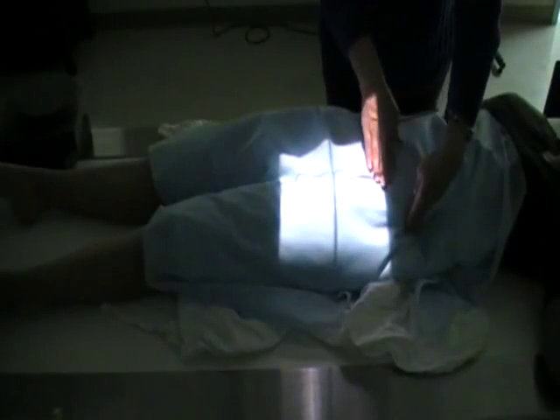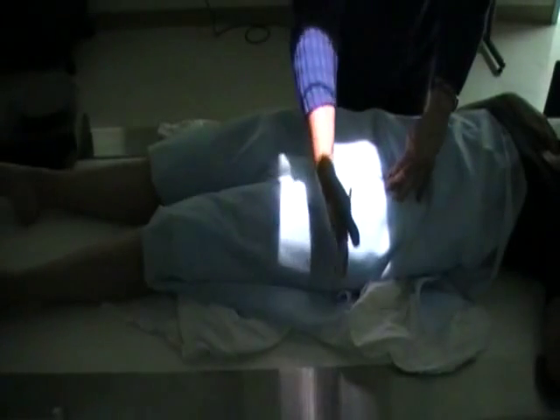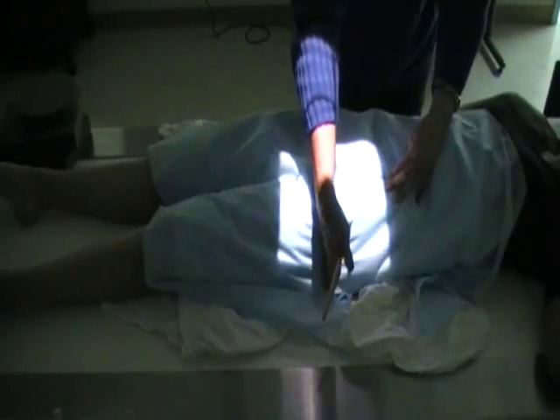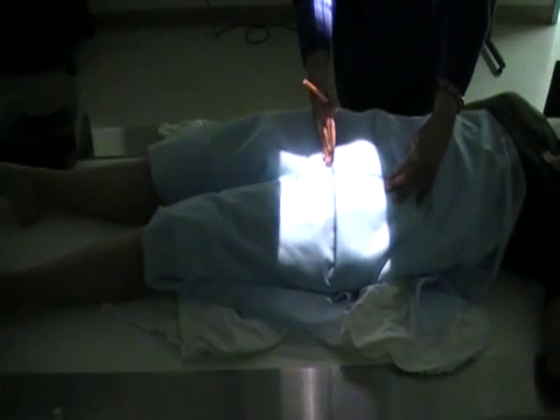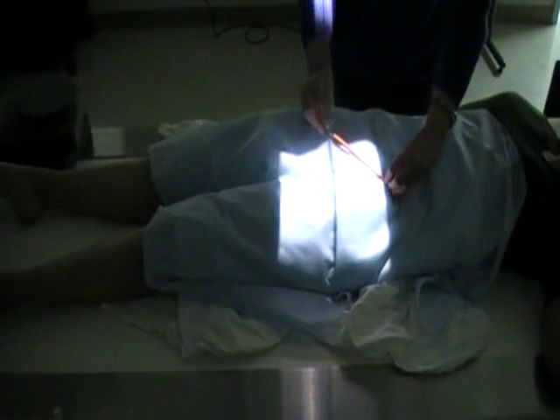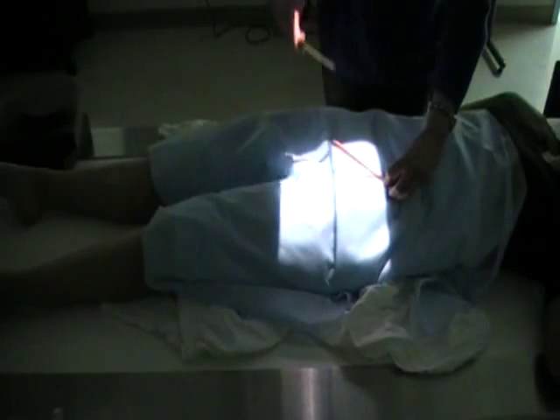For the hip x-ray, we're going to do the AP and the frog leg lateral. First on the AP hip, to help localize where the hip joint is, palpate on the patient the ASIS, and then the pubic symphysis is going to be at the same level as the greater trochanter prominence. So this is the level of the pubic symphysis. So we're going to draw our line there, and I'm just placing out lines with my sticks.